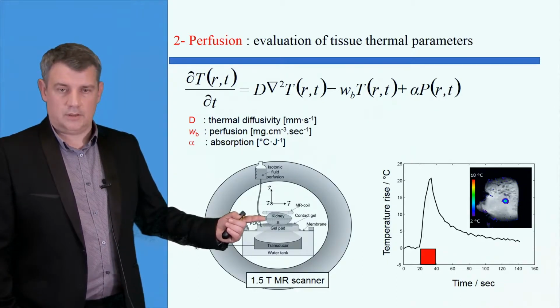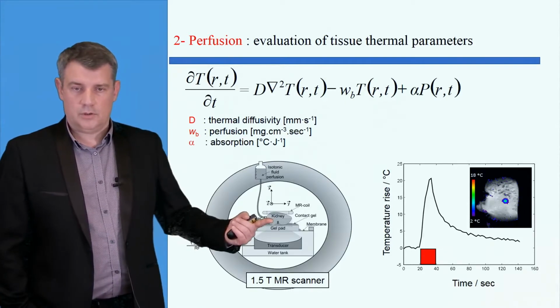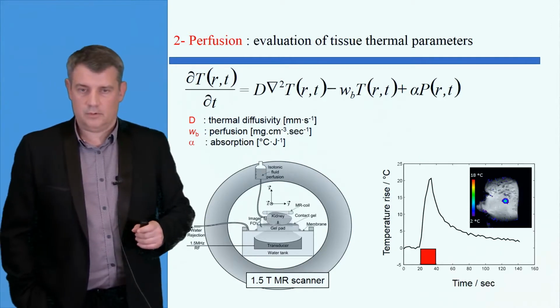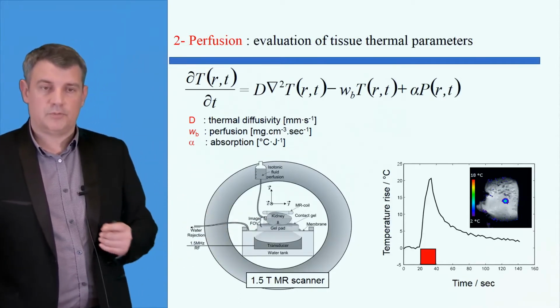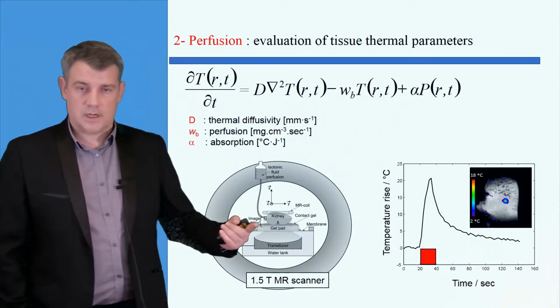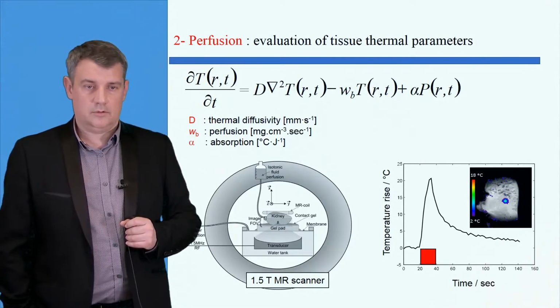You can, for example, take the kidney of a pig and perfuse the artery with isotonic fluid, and then you position your kidney on top of a HIFU system at the center of the magnet, and you can acquire rapid MR thermometry and multi-slices to measure the temperature distribution in 3D during the treatment. So if you take, for example, the central slice that is positioned at the focal spot, you have the curve that is displayed on the graph on the bottom right.